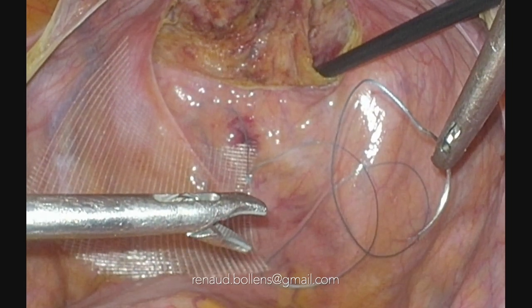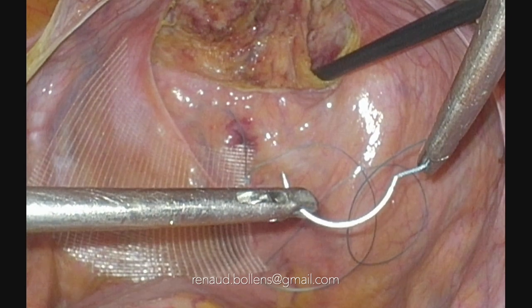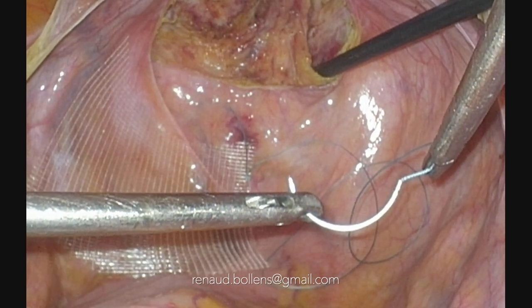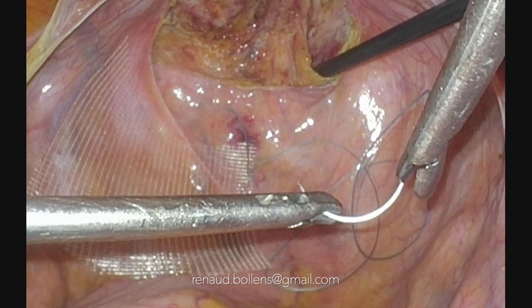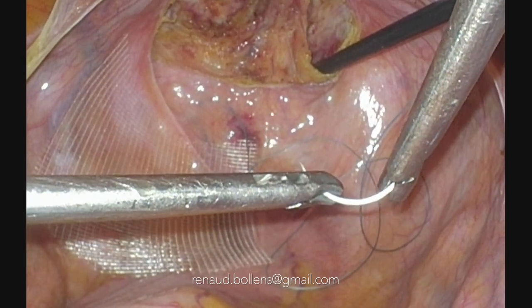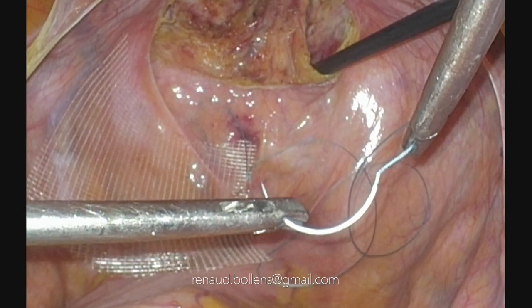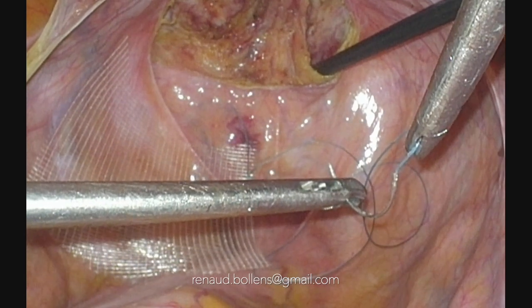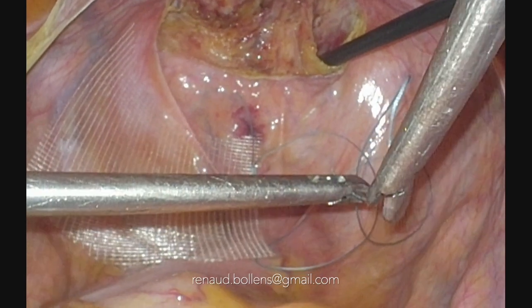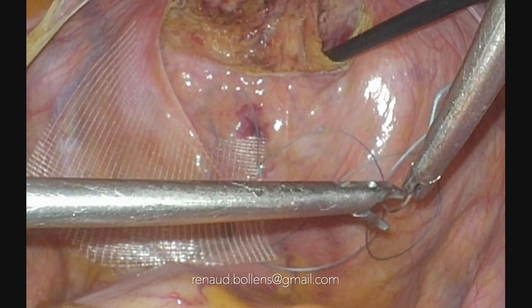this position, okay? Well, if you want to place in 90 degrees, you take the suture and you pull laterally the needle. You turn a little bit the left one just to present it in the perfect manner, and then you catch the needle. If you want to have 45 degrees, you have to pull the suture, the tail of the needle, in the direction of the camera, and then with just additional rotation, you can present the needle exactly in the position to catch it.